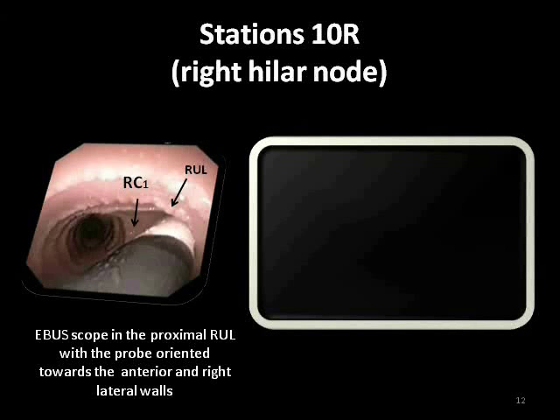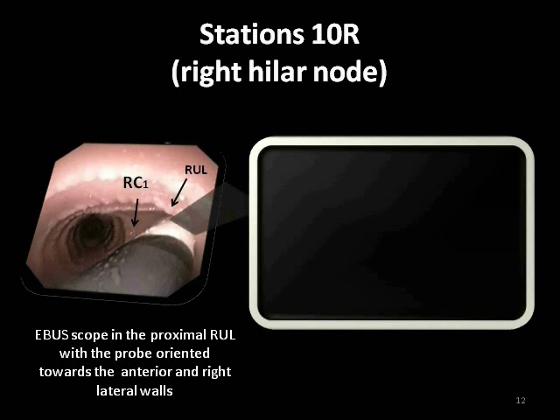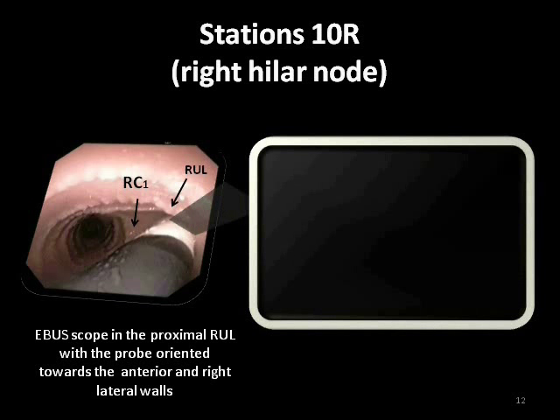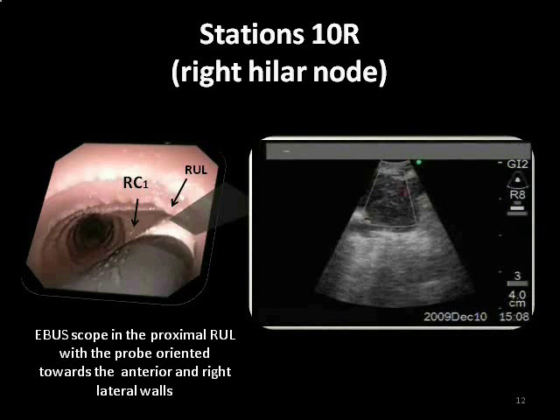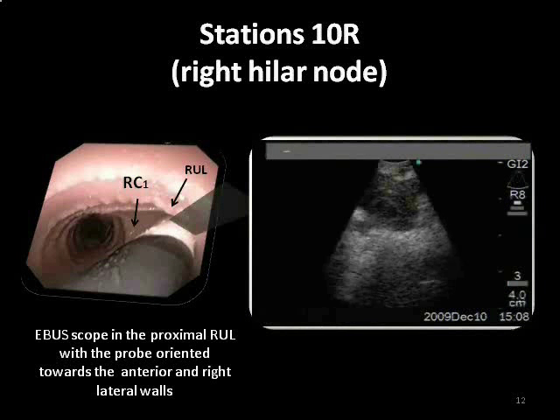The EBUS scope can be gently advanced from the carina to the origin of the right upper lobe bronchus. The transducer is oriented anterolaterally towards the 2 o'clock position. The lymph node is visualized in front of the normal lung.